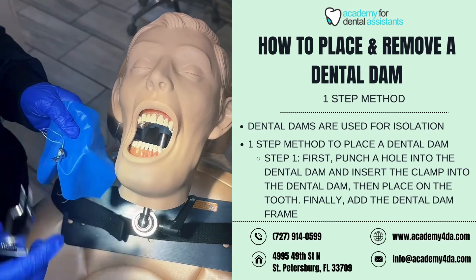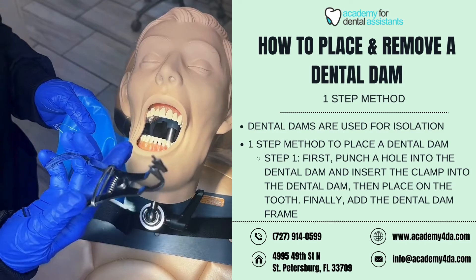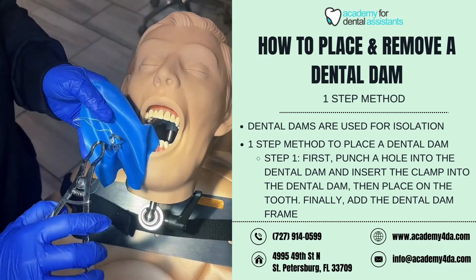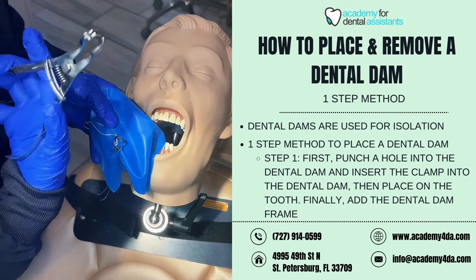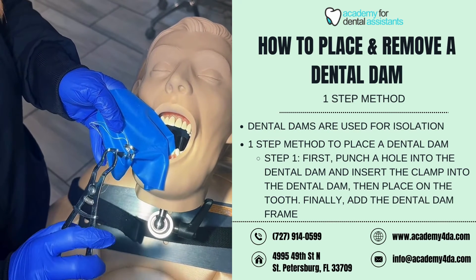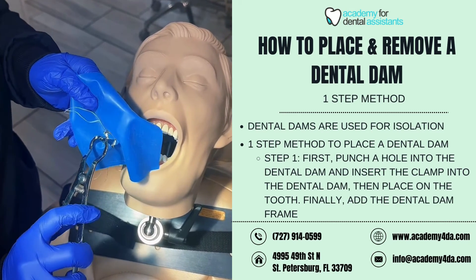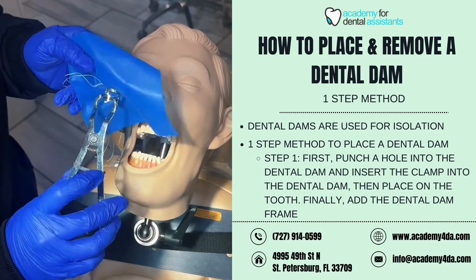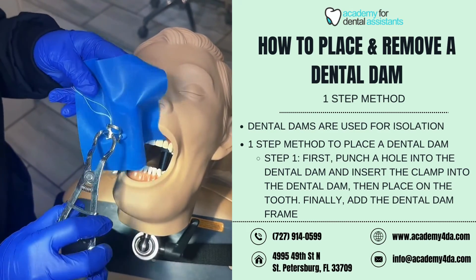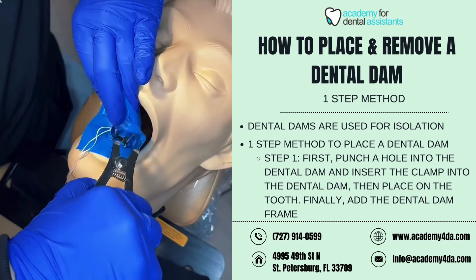Now that I have my dental dam clamp inside of my dental dam for the one-step method, the next step is to place this on the mouth for tooth number 28. I'll pick up my dental dam forceps, make sure the locking mechanism is forward, line up the prongs or beaks of the forceps inside the holes of the dental dam clamp, squeeze as tight as I can, and push the locking mechanism into place so I don't have to squeeze and hold it.